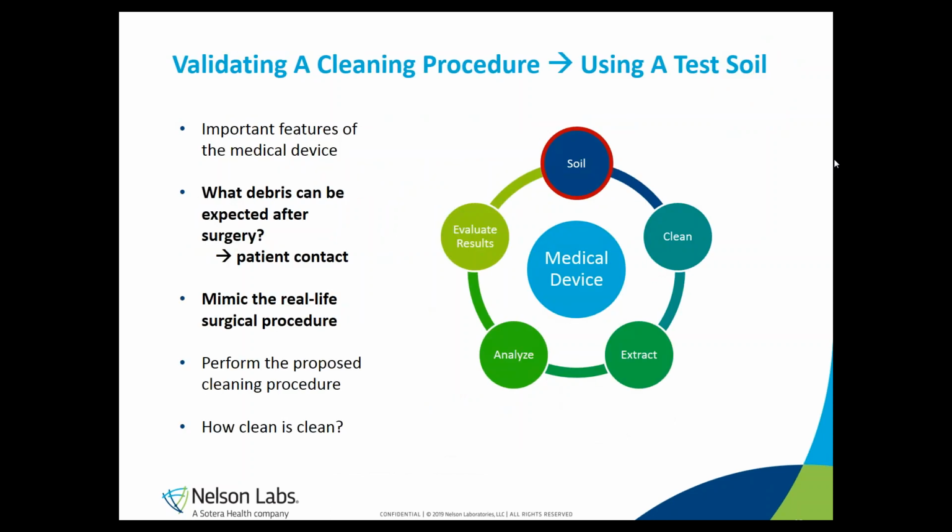Okay, we now have discussed in the couple of slides the design features of the medical device itself. And now we are going a little bit deeper into soiling procedures that are used during cleaning validation studies. Therefore, we will always take into account the type of patient contact to identify possible residues that may stay behind on your device after surgery, and we will mimic the real-life surgical procedure as much as possible to get really a representative soiling of your device.